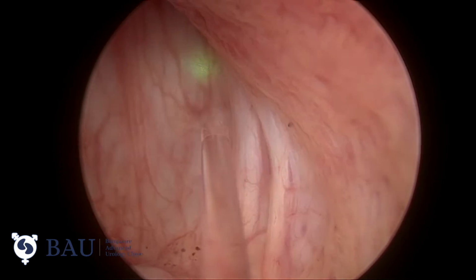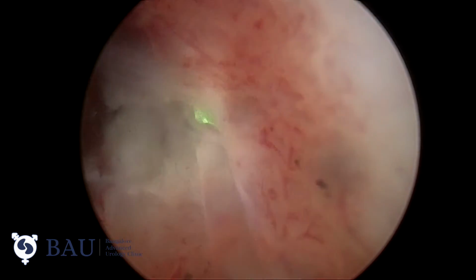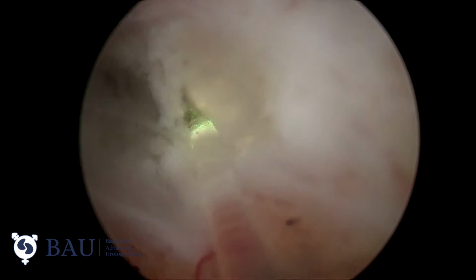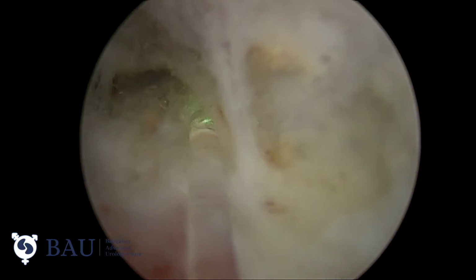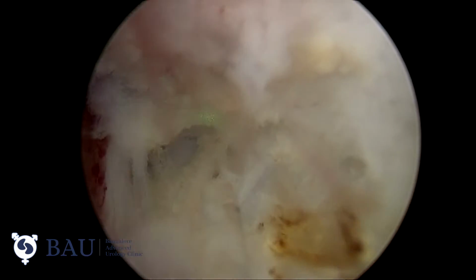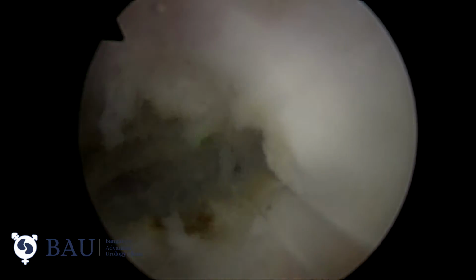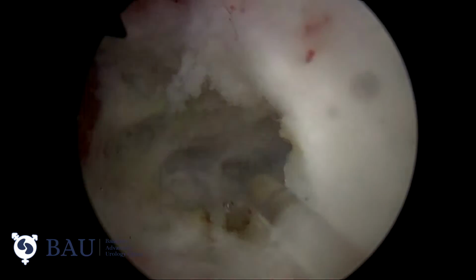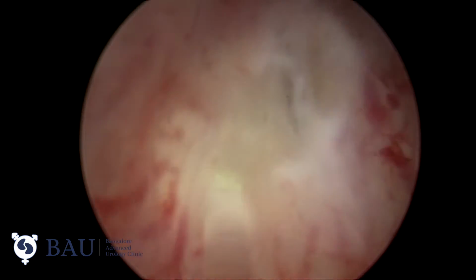First I will release the mucosa lateral to the verumontanum. This is the thinnest layer of that mucosa, and as soon as we open the mucosa, we directly enter into the plane between prostate lobe and capsule. Here you can clearly appreciate the capsule and lobe, lateral lobe. As soon as we identify the correct plane, we proceed a little bit. So here you can clearly see how nicely it is getting separated without any mechanical push.